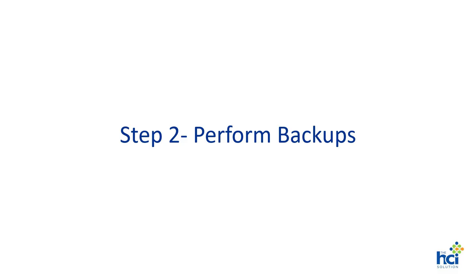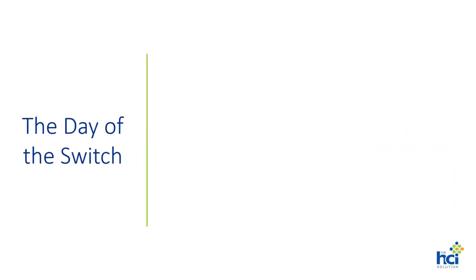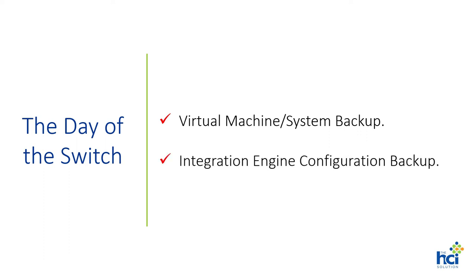With the new Postgres database installed, it is time to proceed with the scheduled virtual machine or Docker container backup. You should perform this operation as close to the time of the database switch as possible. The next step is to perform a backup of all interface channels and server configuration. Remember, the server backup configuration feature does not backup users, events, or stored messages.